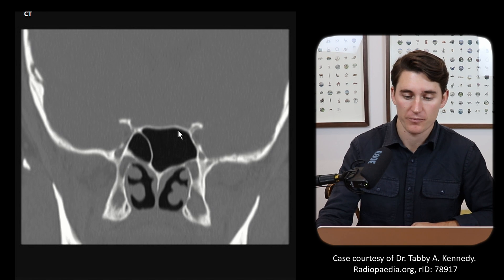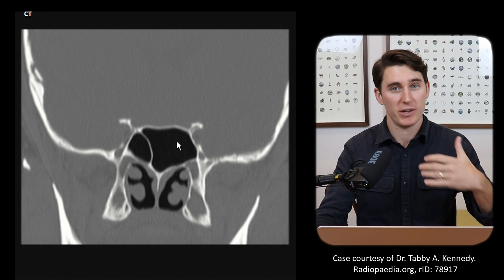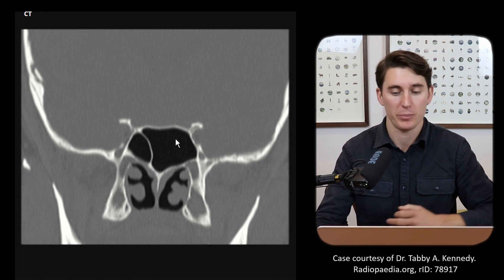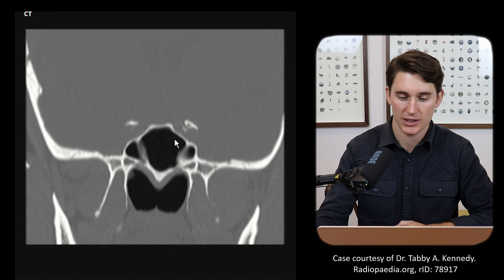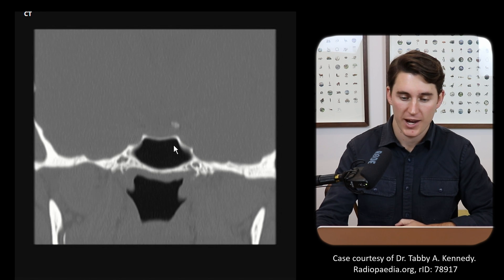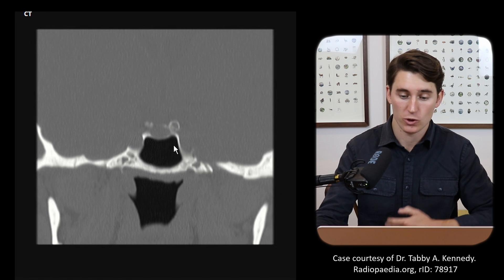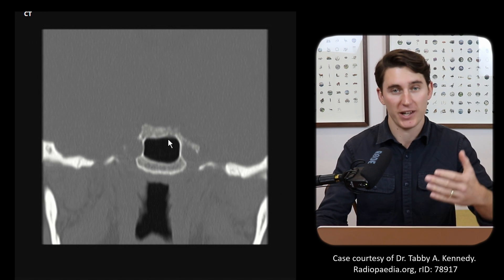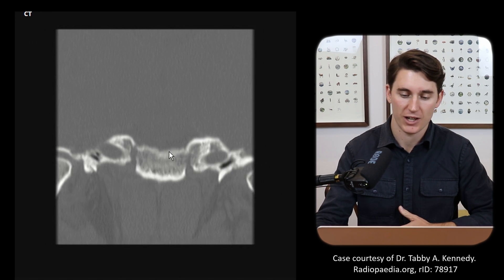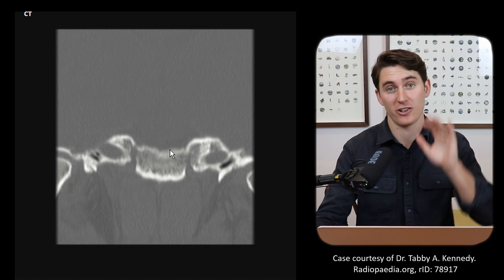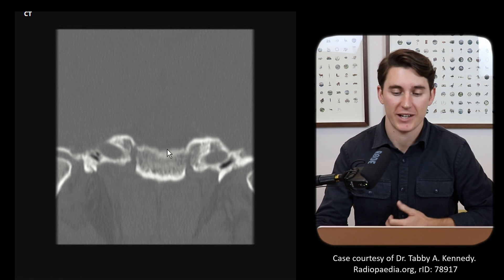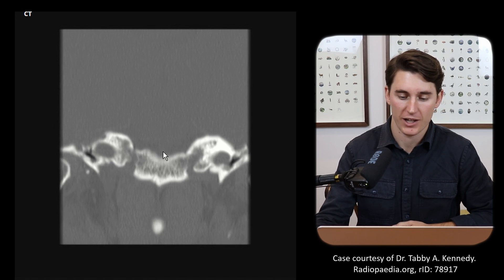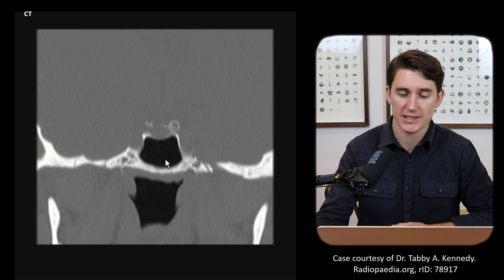Here we can see our sphenoid sinus at the level of the anterior clinoid processes. As we head more posteriorly we should see that dip into the sella turcica, which dips down, and then we come up to the dorsum sellae with our posterior clinoid processes. As we head even more posteriorly we'll see our clivus forming here — that's where our basilar artery will be on the other side of that clivus.